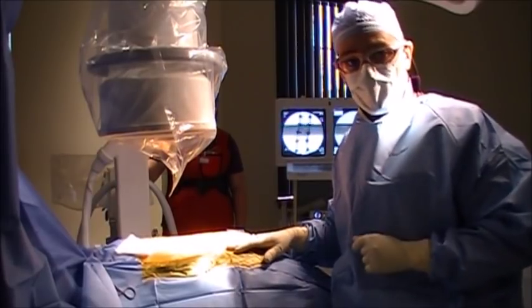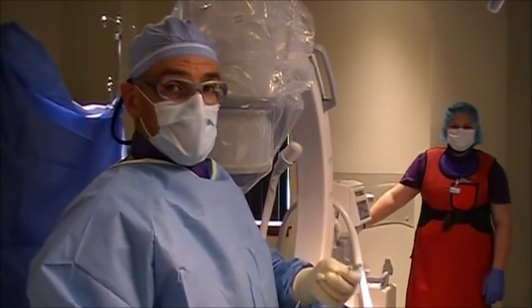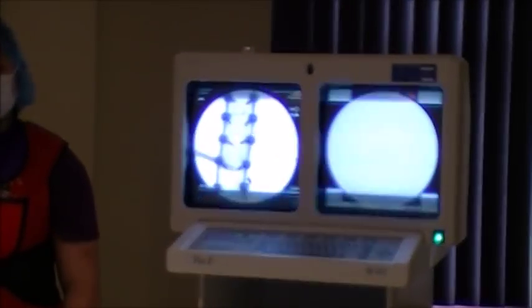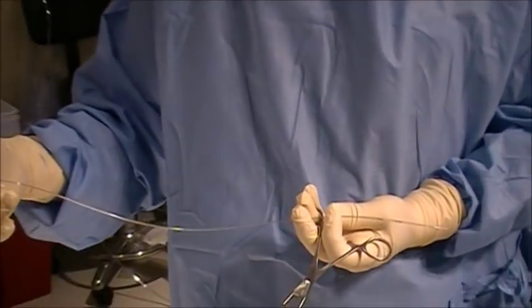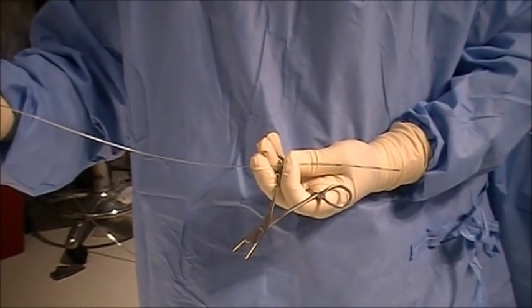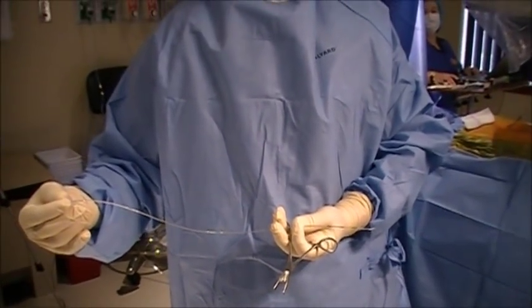I've now entered what I feel is the epidural space using the loss of resistance technique. Directing your attention to the fluoroscopy monitor, this line here is the tip of the needle going right into the opening between the two laminae, which I believe is the epidural space. This is the actual percutaneous lead or wire — there are four contacts at the end — and I'm going to place this wire through that needle and advance it up about eight to ten inches under x-ray guidance.